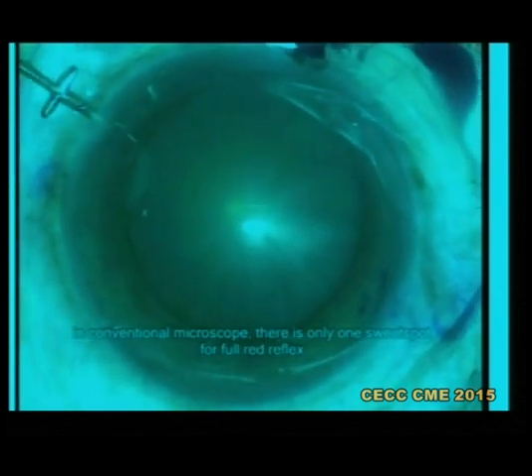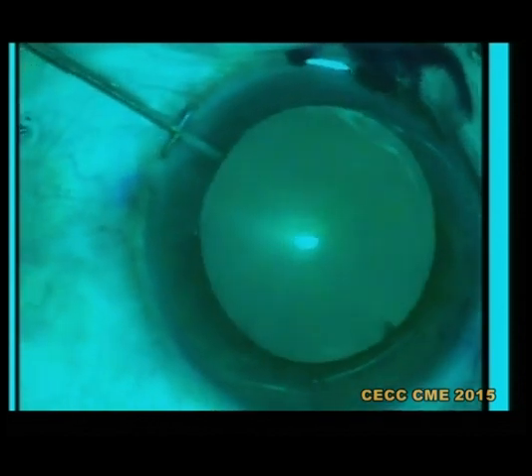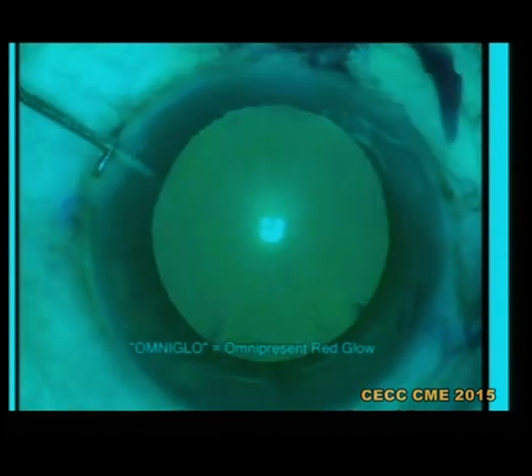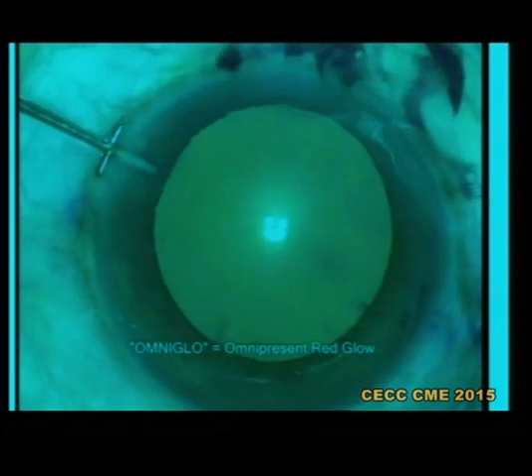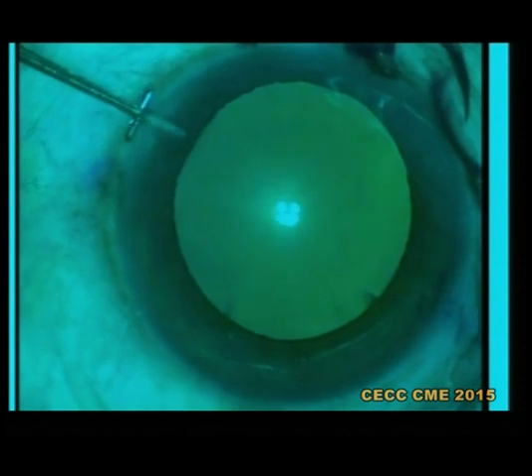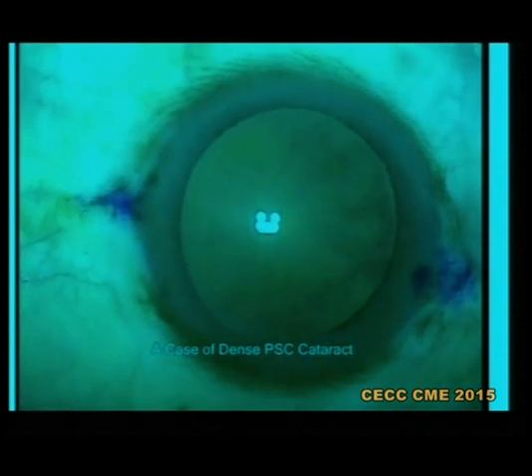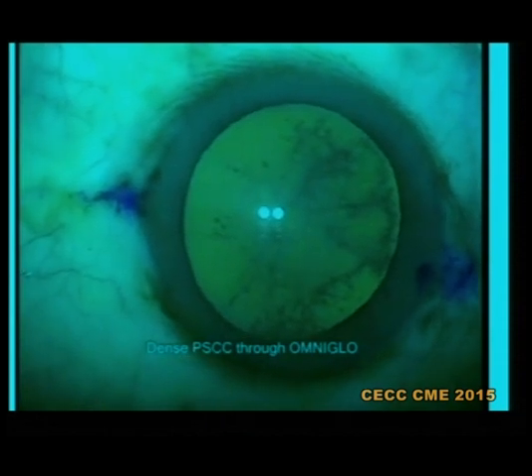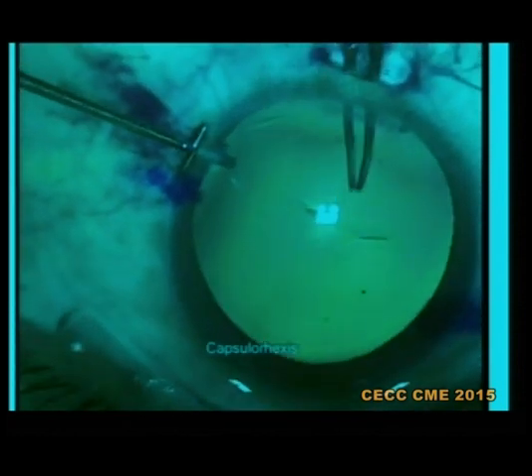In a conventional microscope, there is a sweet spot — you will get full glow only at one place, and it keeps coming and going; you have to slightly manipulate. But when you switch on the OmniGlow stereo coaxial red reflex, the glow is uniform and full throughout the position of the eyeball. And when the disc comes in front, the glow becomes so bright. If you tilt the eyeball a little and the disc comes in front — let us see a case of dense PSC cataract — even in a dense PSC cataract you can get very good glow.